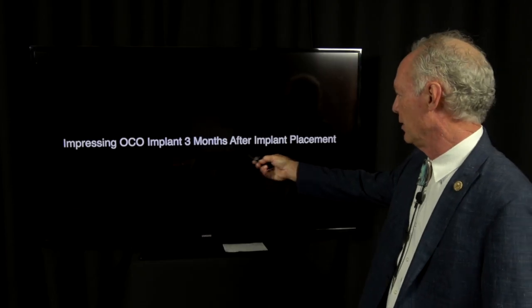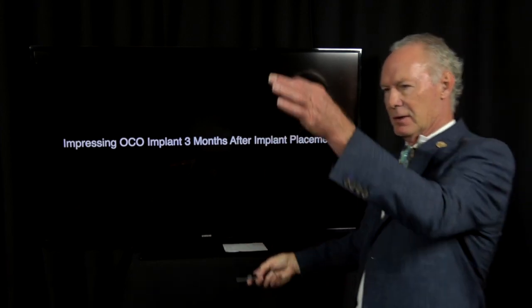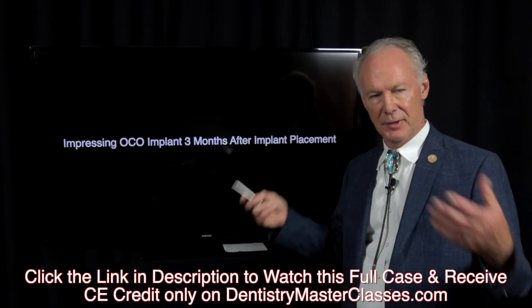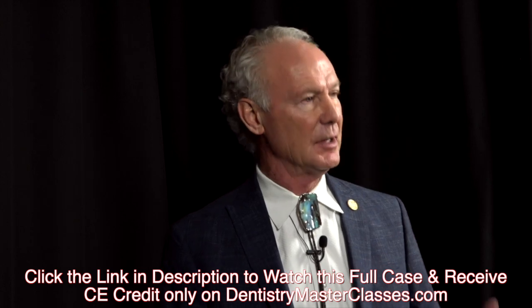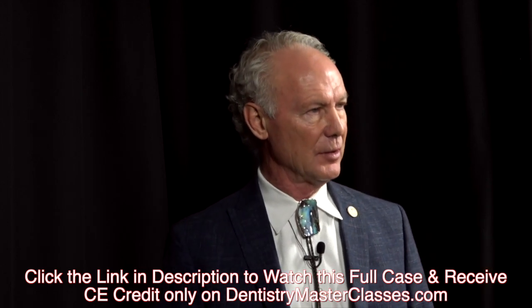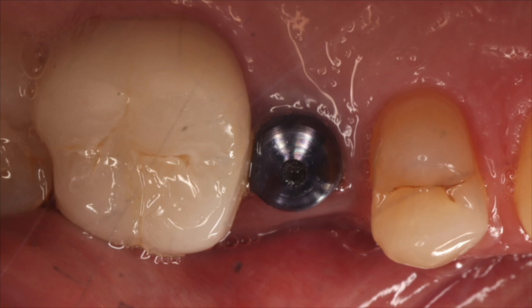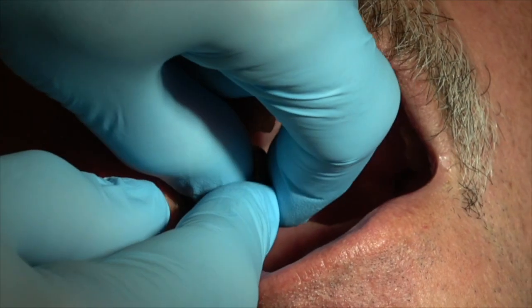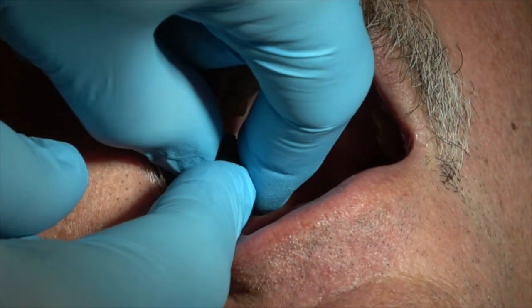I'm impressing the implant three months after implant placement. The healing abutment has been through the tissue all that time — it's developed a perfect emergence profile. You don't have to anesthetize the patient to take the impression when they return, and you don't have to reflect a flap because you went through the tissue. I've done it this way for a long time and it works beautifully, and there are a lot of advantages in my opinion.